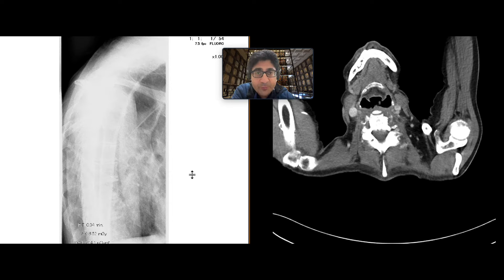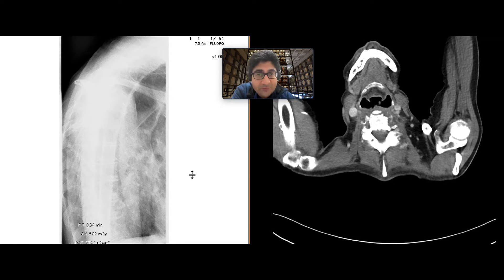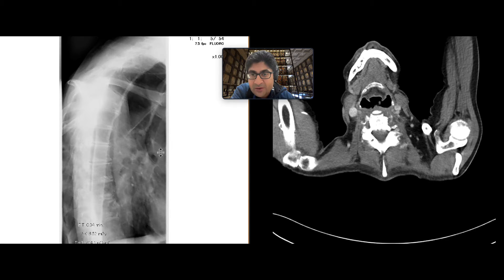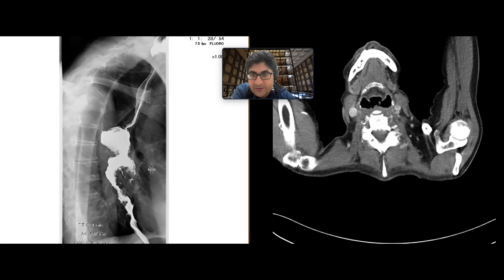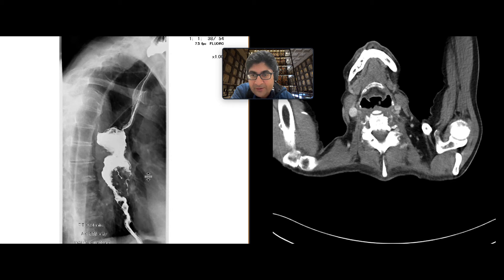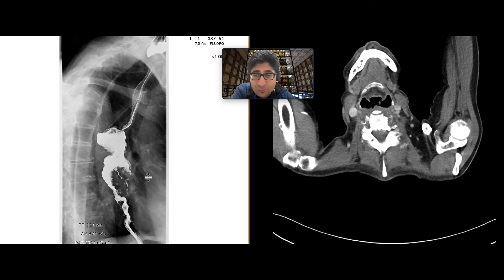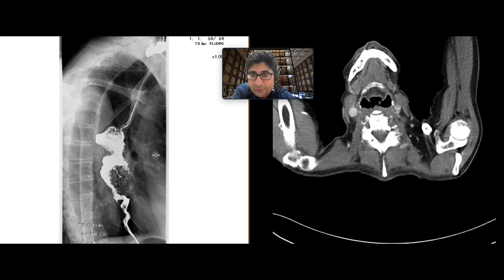This is a patient who came to our department with dysphagia, and we got an esophagram to evaluate this. We can see pretty early on in the esophagram, as we give the barium, that there's an irregularity, and in the mid-esophagus the wall of the esophagus is quite irregular.